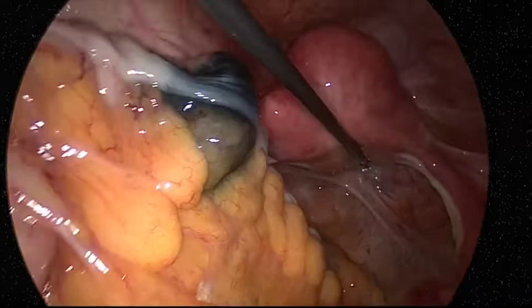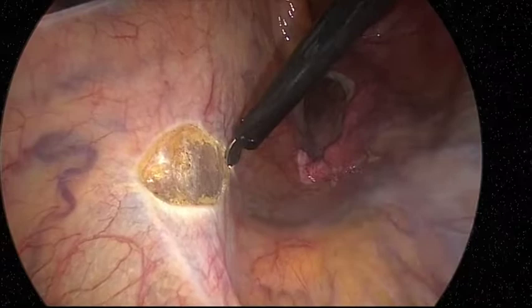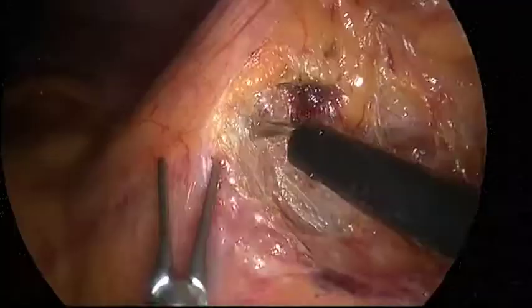India ink injected near the tumor is seen. Medial retroperitoneal dissection of the mesocolon is started. An electric scalpel is inserted through the right lower 5 mm port. The other 3 ports are all equipped with 3.5 mm forceps. Dissection proceeds cranially.